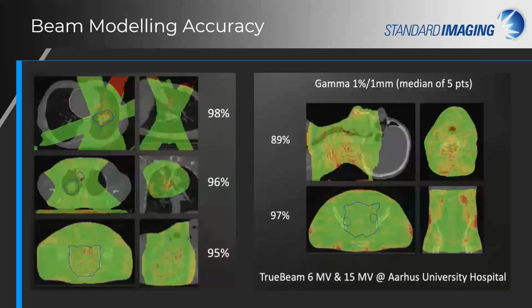As I previously mentioned, historically, second check calculations were known to be less accurate dose estimates compared to your treatment planning system. So often any significant dose differences were usually reasoned away, or they prompted machine QA. This truly defeats the purpose of a secondary dose check, in my opinion, especially for complicated plans that may push the limits of your treatment planning system algorithm.